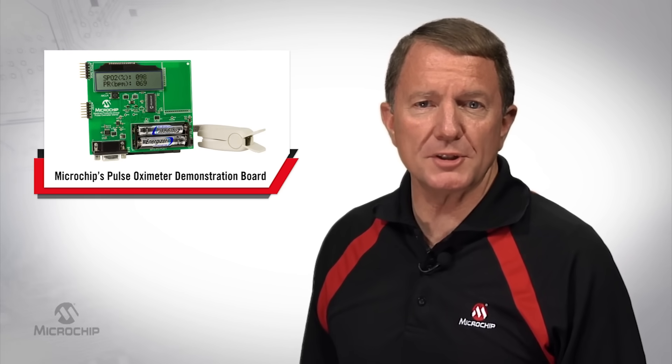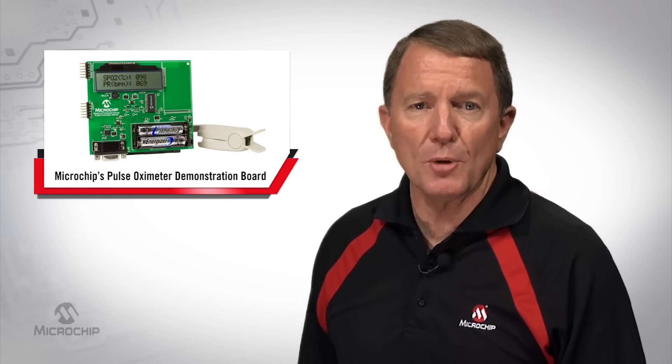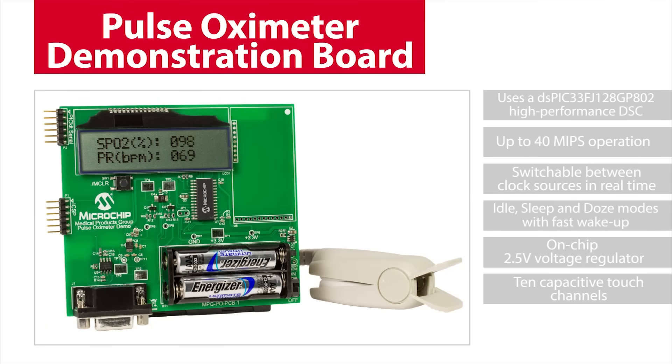This reference demo board helps designers develop a low-cost, handheld, or wearable pulse oximeter with user interface, which is capable of measuring both heart rate and blood oxygen level. Microchip's Pulse Oximeter Demo Board can be used to start development of a low-cost, low-power hospital or clinical pulse oximeter design, but it can also be used as a starting point for a wearable activity tracker design that can measure heart rate and blood oxygen level.